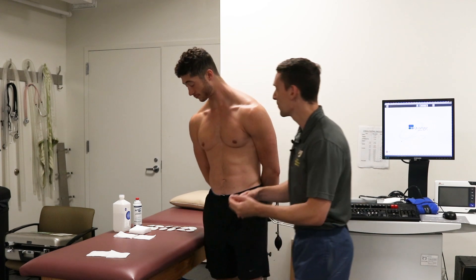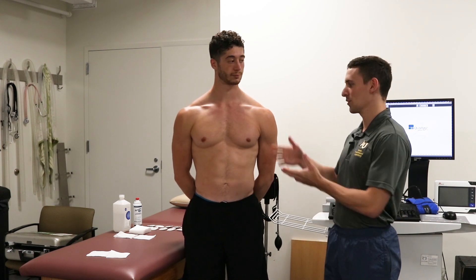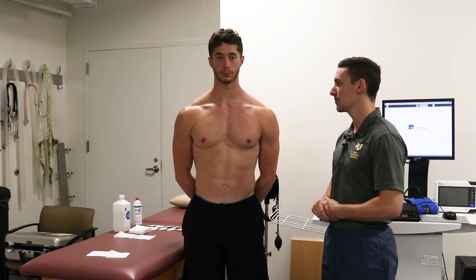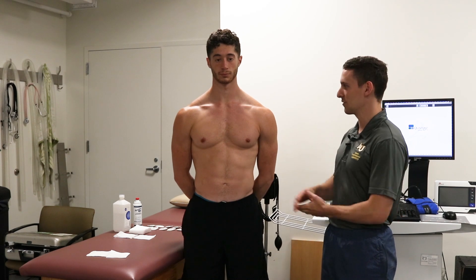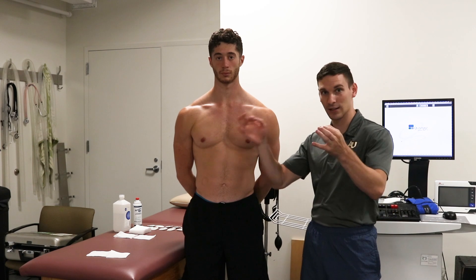Our friend Jacob has agreed to be our subject. The first thing we need to do is have them take their shirt off. Upon taking their shirt off we're going to examine their chest. Thankfully Jake does not have too much hair here. Some people do and if they did we'd have to shave that to allow for better sticking to the skin.